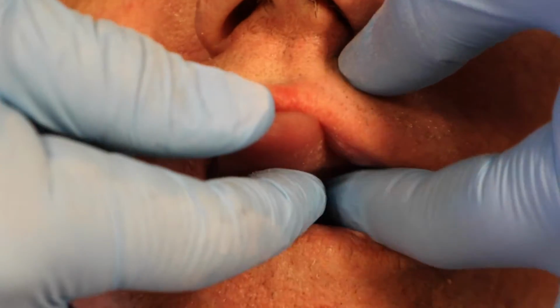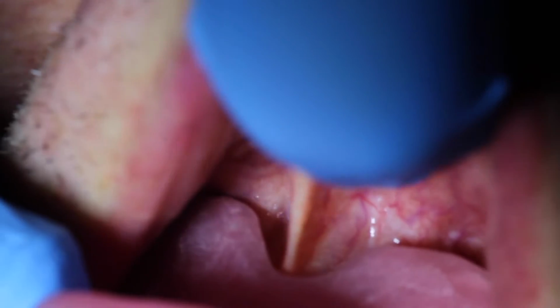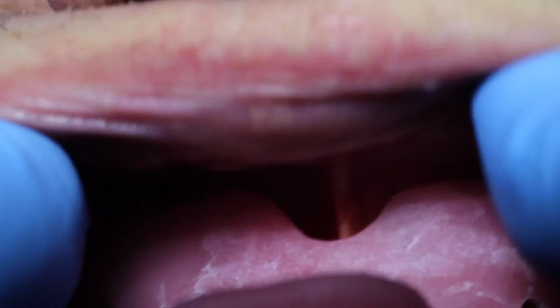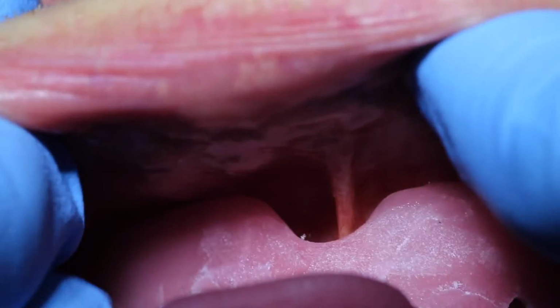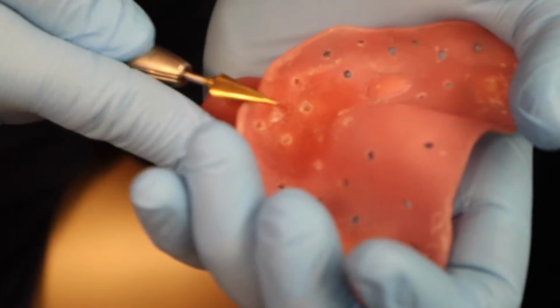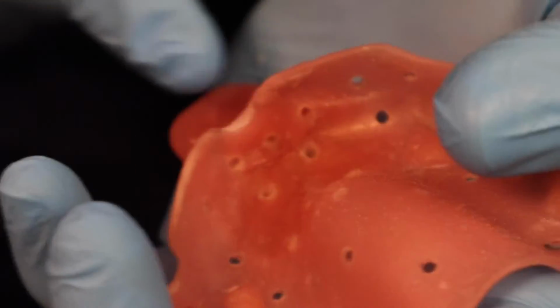But I wiggle the patient's lips around, and I pull down, and anywhere that it's interfering, it's going to displace my tray. See how here the frenum is pinched? So when I pull that lip down, it's actually going to push my tray out of the way. And so what I actually do is I go all around the mouth and I push down, and wherever my tray is pushed out of the way, that's where I know I have to adjust.